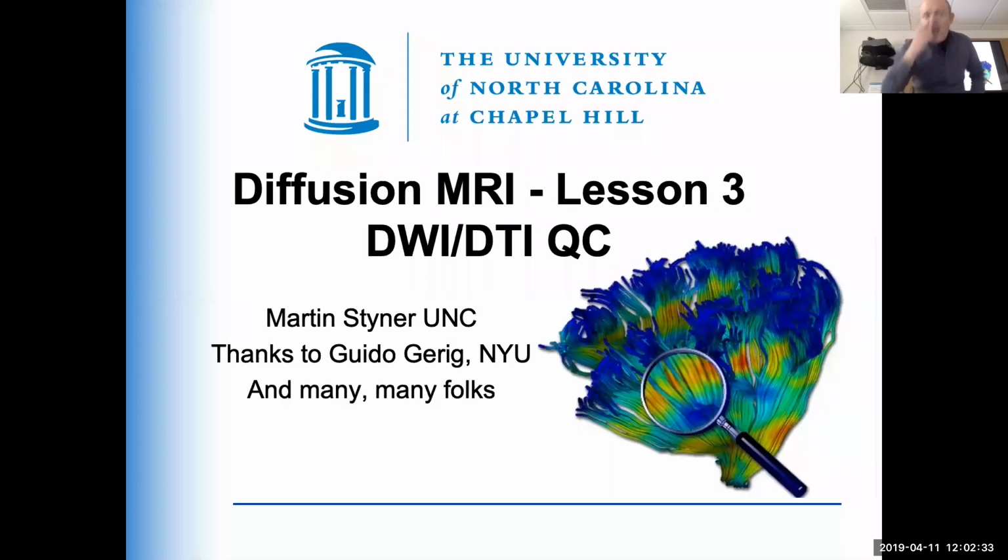All right, guys, let's get started here. So this is the third lesson on the Diffusion MRI crash course. Today it's going to be all about quality control. We're going to have a general introduction plus some hands-on things, and at the end it's going to be a small demo. Again, as before, it's about an hour.